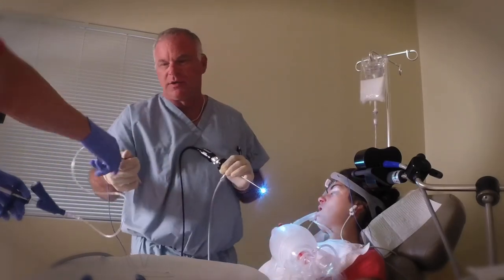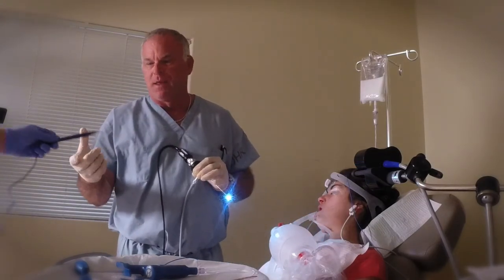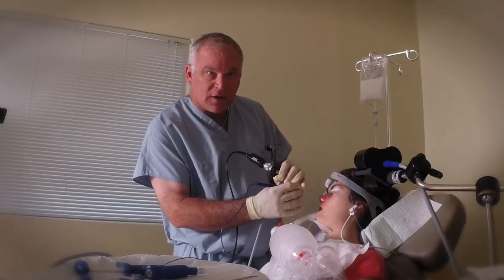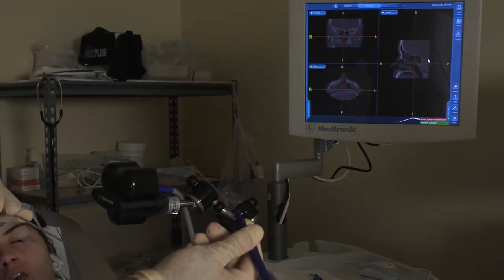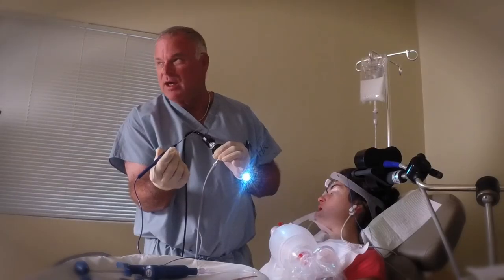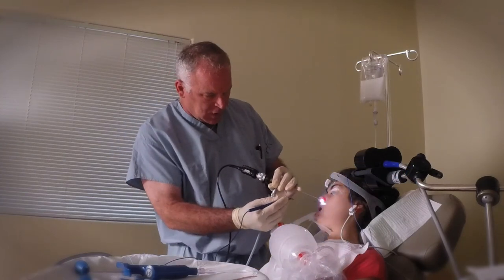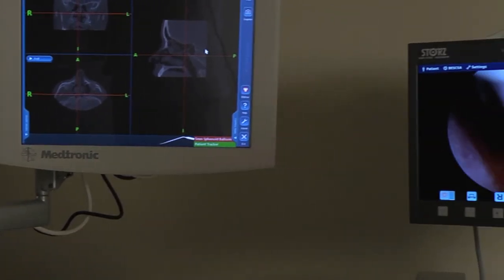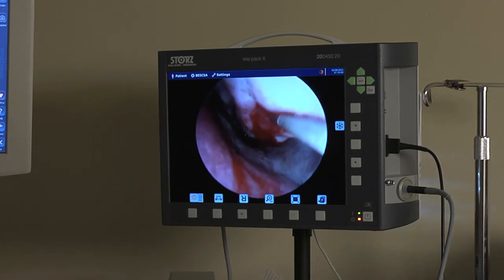Now we've done all six sinuses. What we're going to do now is go in and burn those inferior turbinates. I injected them earlier, which really facilitates this process called ablation. If you look, it's just a needle. And that needle is going to go right down for what's called the inferior turbinate. It's going to destroy the turbinate on the inside, make it shrink and become smaller. Turbinates are what cause most of the nasal obstruction. Right now I've got them sprayed with Afrin, so they're small. But these things cause obstruction to airflow.